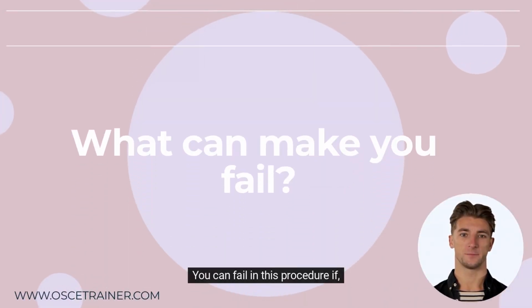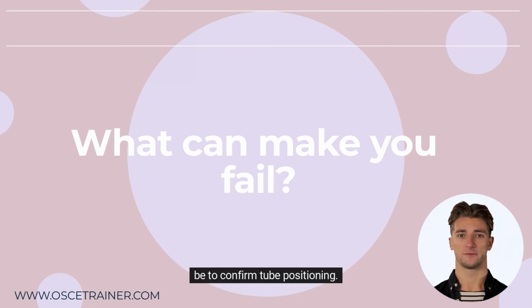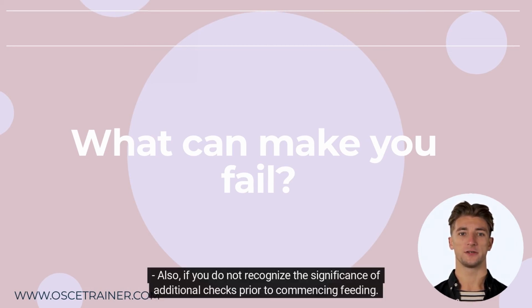You can fail in this procedure if you do not recognize the significance of a displaced tube. That is, you are not able to state what pH should be to confirm tube positioning. Also, if you do not recognize the significance of additional checks prior to commencing feeding.